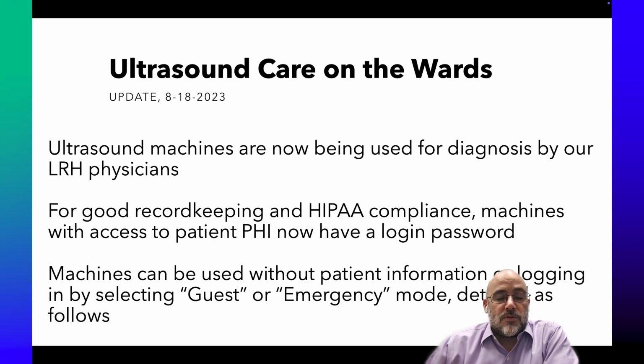So right now, the ultrasound machines that are being used at Lakeland are also being used for diagnostics, including by the different physicians on the floors. So as a result, the machines will have access to the patient work list, which includes patient information. As a result, there is a login that is required on all the machines.